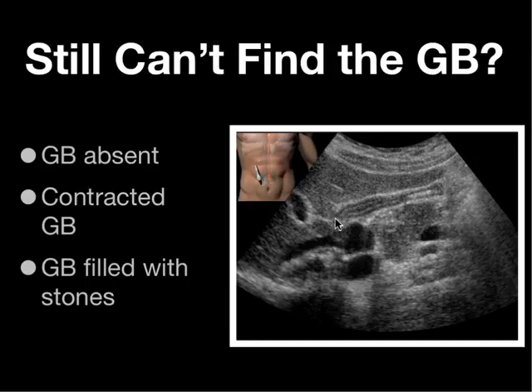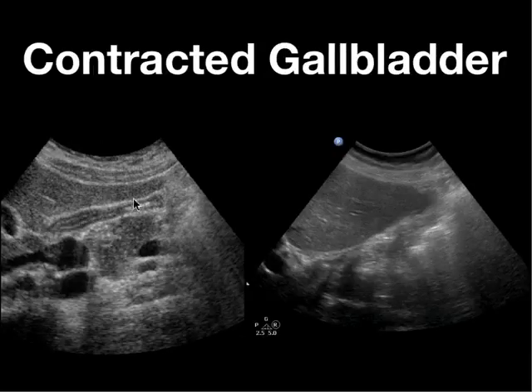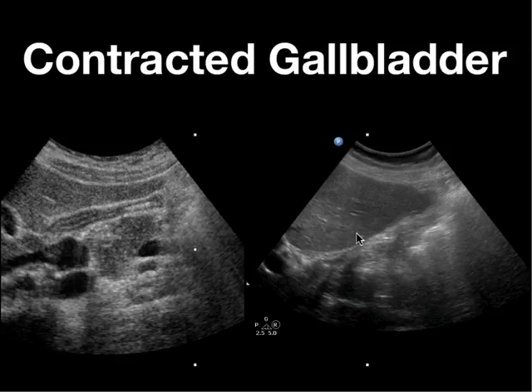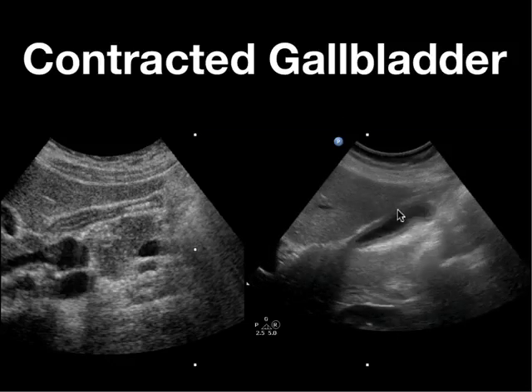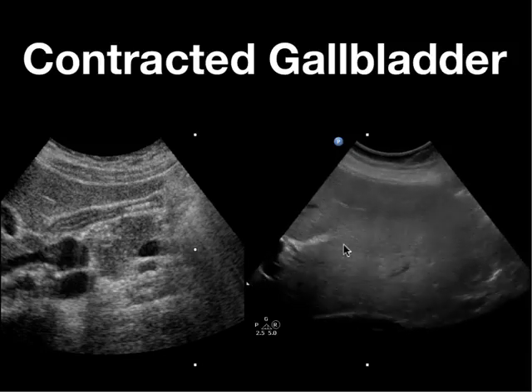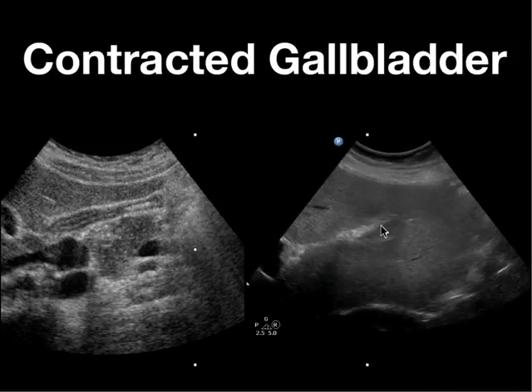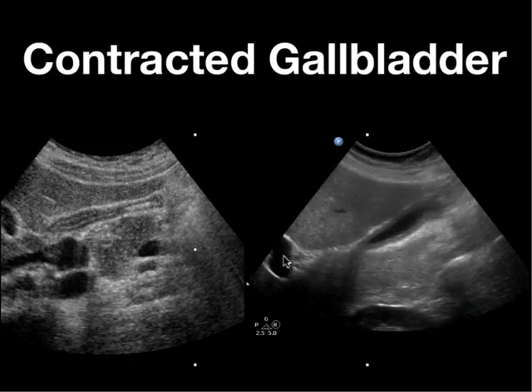It's also possible that the patient could have an ectopic location for their gallbladder. Here are some examples of contracted gallbladders, which can be very difficult to find — you're going to have to rely heavily on the main lobar fissure and the anatomic association with the right portal vein. Here's another patient who had just eaten; you can see there's still some bile within the lumen, and you can see the main lobar fissure and the right portal vein confirming this is the gallbladder.